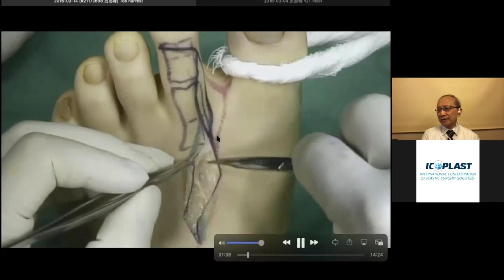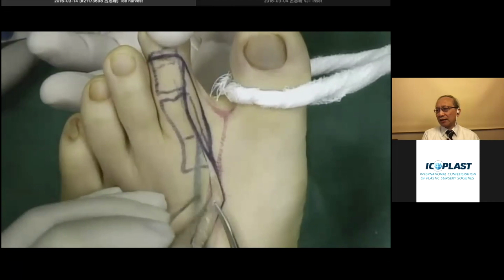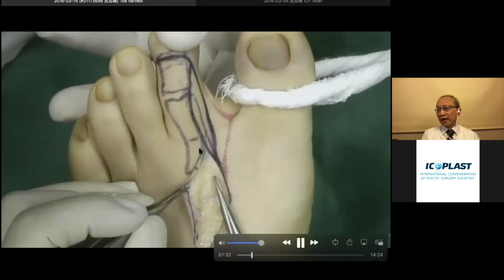And under the tourniquet, be sure that when you do the exsanguination, do not do a full exsanguination to exsanguinate all the blood from the foot. That allows you to leave some blood inside of your vein, so it will be easier to find these veins with a different color.